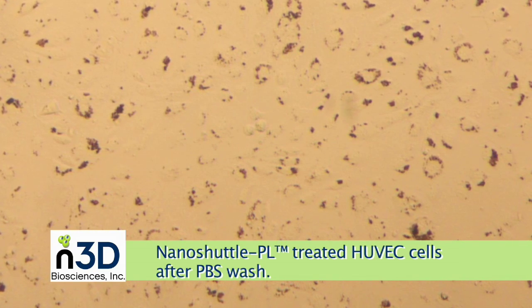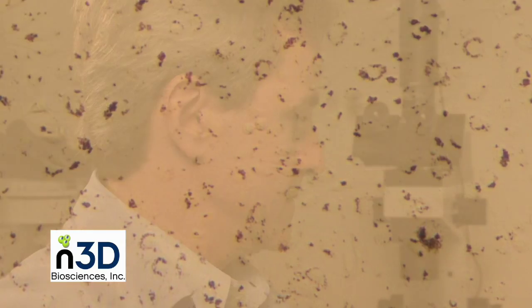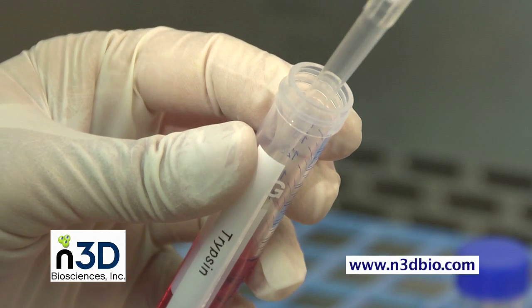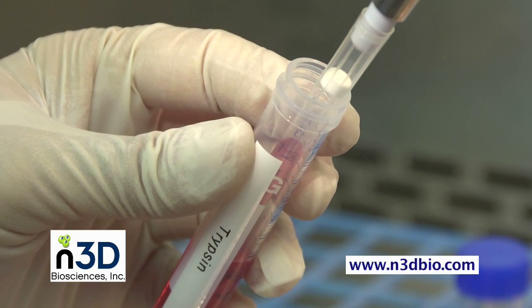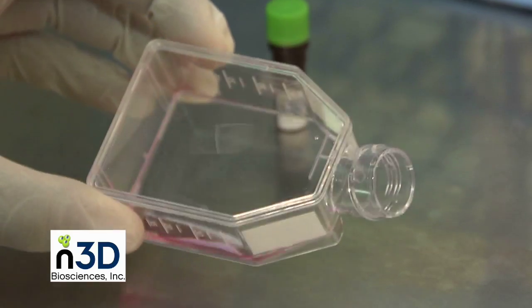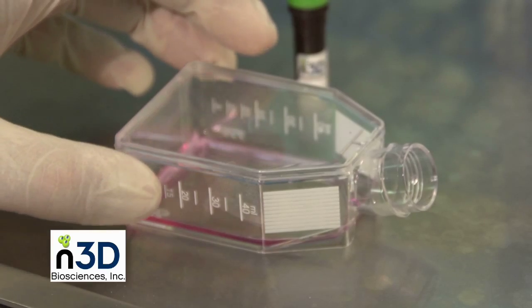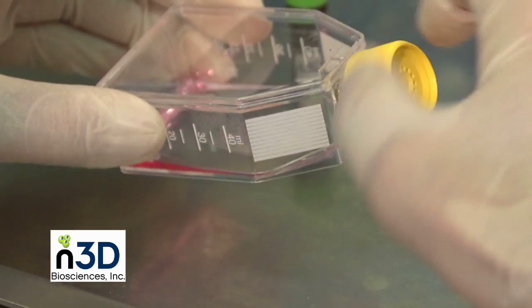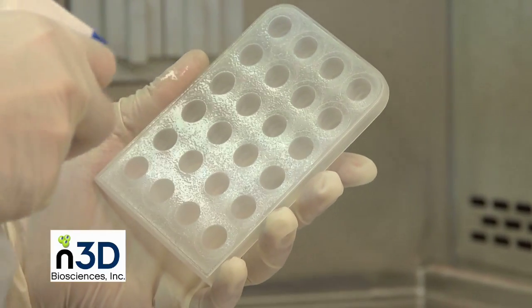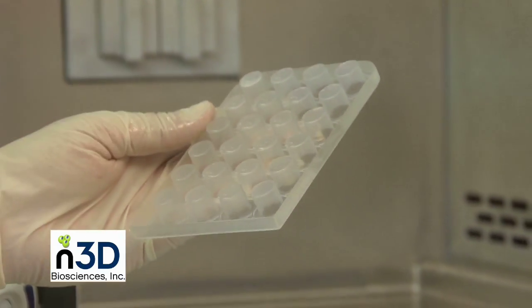The slight darkening of cells indicates the uptake of biocompatible nanoparticles that are required for levitation. Cells must now be detached from the flask. We recommend adding enough trypsin EDTA solution to cover the adhering cell layer. Since cell detachment protocols are cell type specific, we suggest following your lab's established protocol. While waiting for the cells to detach, clean the magnetic drives. If using the 24 or 96-well formats, clean the culture isolation lid with 70% ethanol and dry under sterile conditions.